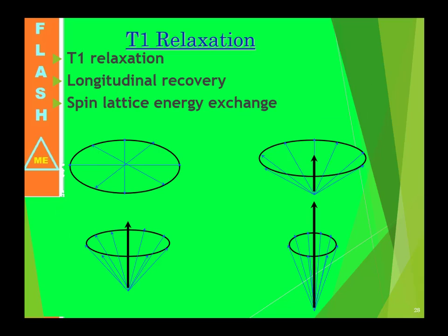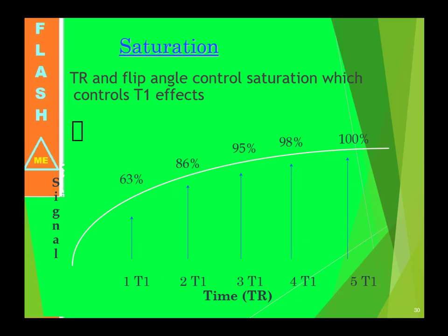T1 relaxation. Longitudinal recovery. Spin lattice energy exchange. Saturation. TR and flip angle control saturation, which controls T1 effects.